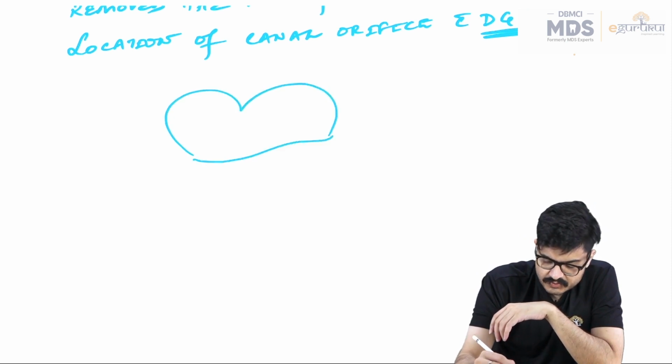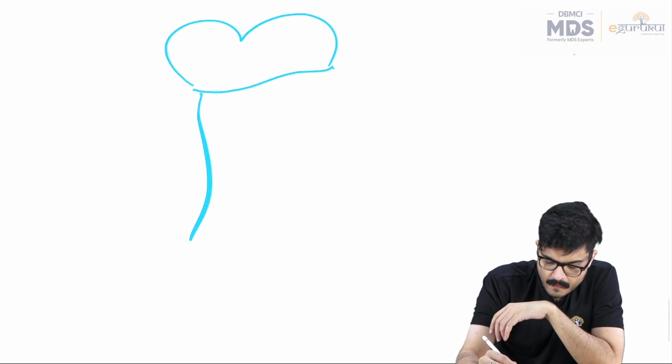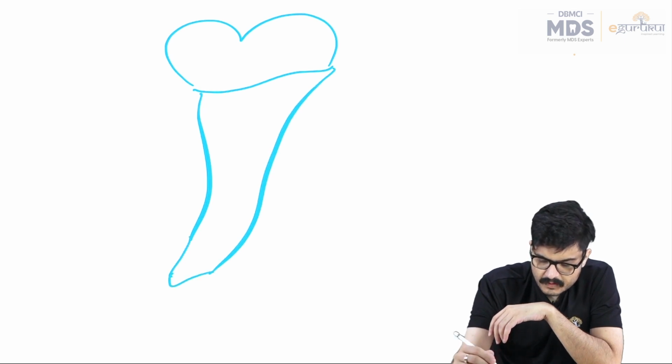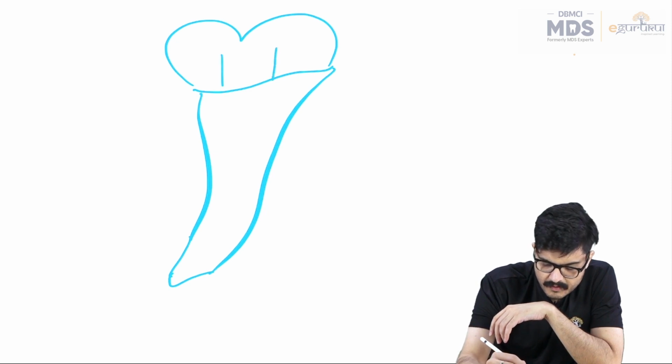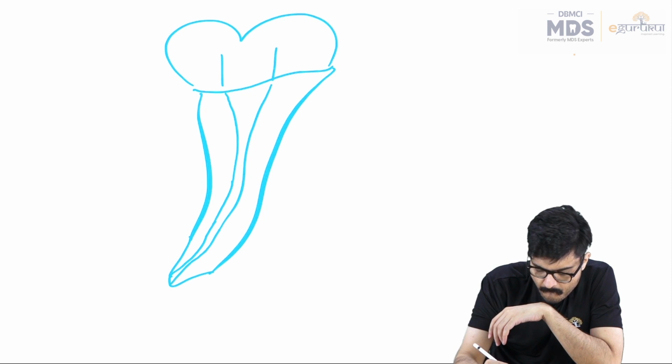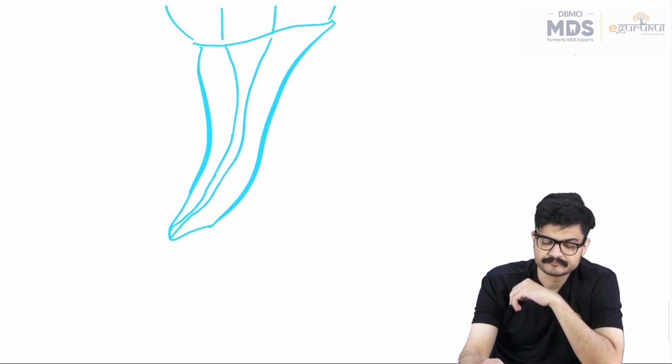So that's my tooth. Right? I've done my access opening. That's my canal. All right.